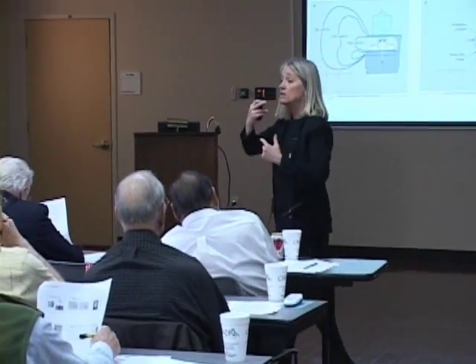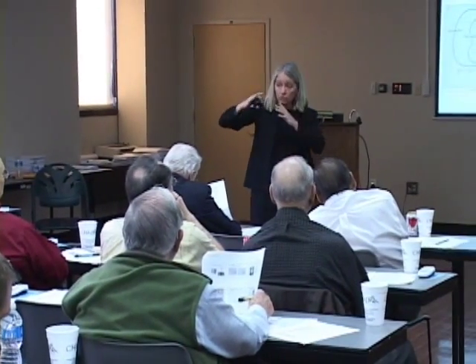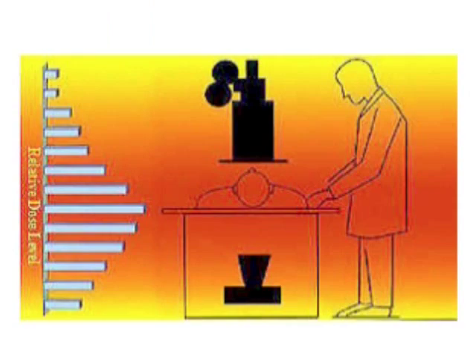But the idea is the scattered radiation is produced isotropically in all directions around the patient, not just in one. It is greatest at 120 to 130 degrees from the primary beam where the X-ray is hitting the patient, but it is produced in all areas around the patient. There was a slide a second ago, this one. This is showing you the exposure levels of dose radiating from the patient. Up in this area, it's the lowest. Right next to the patient where his hands are, because there's no shield, it's the highest, and then at the table base it drops down again.